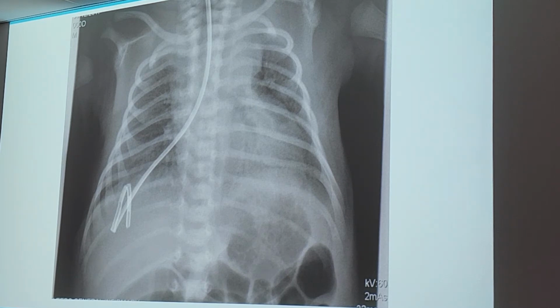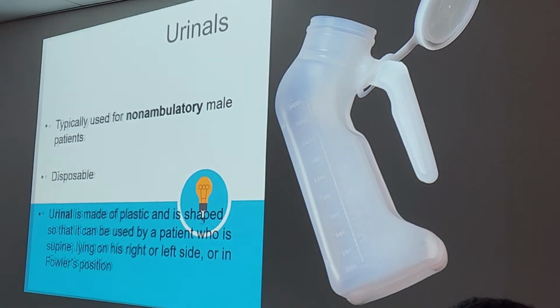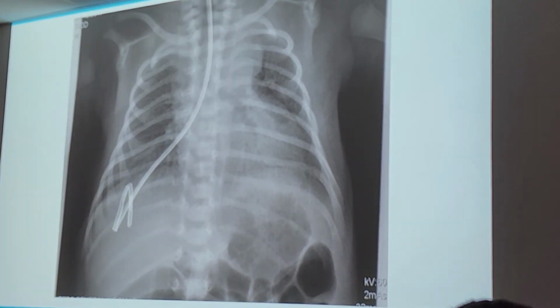Is this a kid? Yeah, looks like a kid, yes. I was going to ask, how old do you think this patient is? Little baby ribs. Look at the shoulders. Probably like a 5-year-old, maybe. It looks like there's lots of air. There may be an obstruction going on in their intestines.